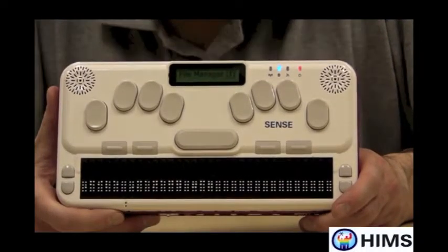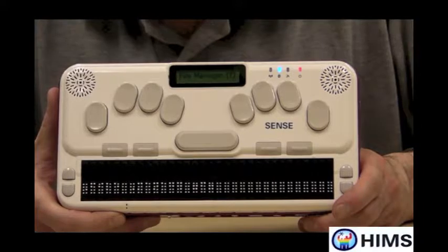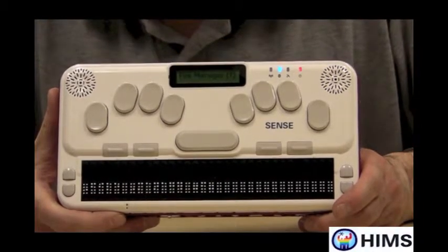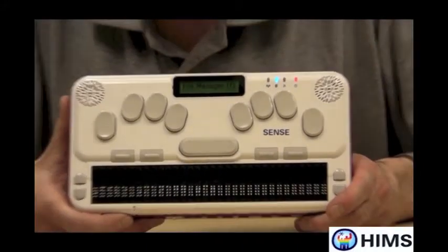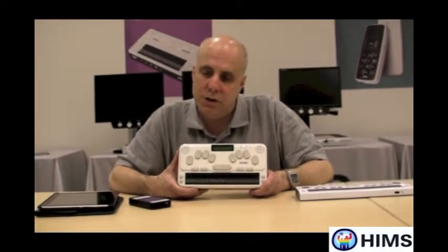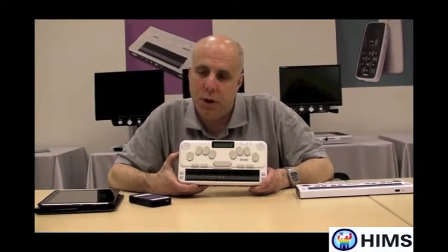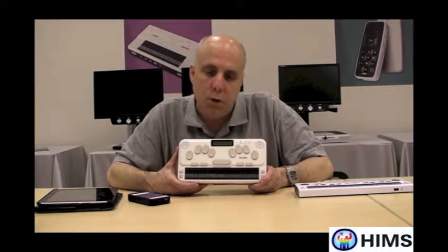But today, we're going to talk about how the BrailleSense U2 can be used as a Braille display for the iPhone. As we all know, the iPhone, iPad, and iPod Touch have really made their way into blind and low vision communities because people can use them — VoiceOver works — and now you can have Braille to go along with that VoiceOver work you're doing with your iPhone.